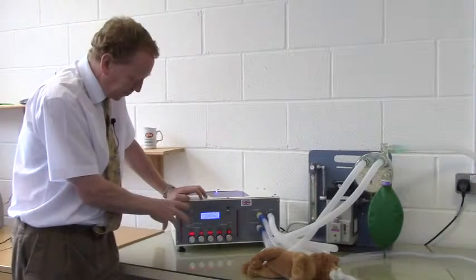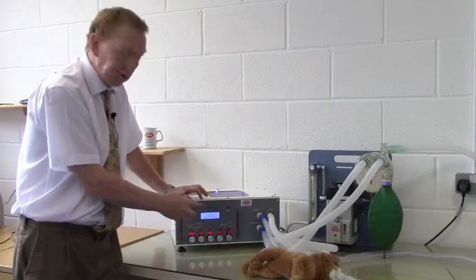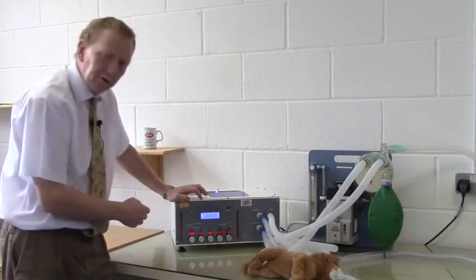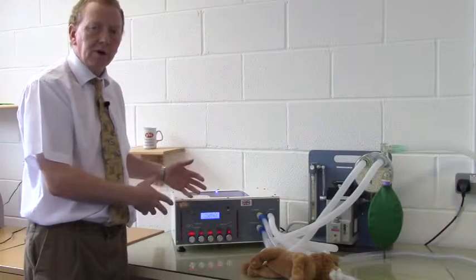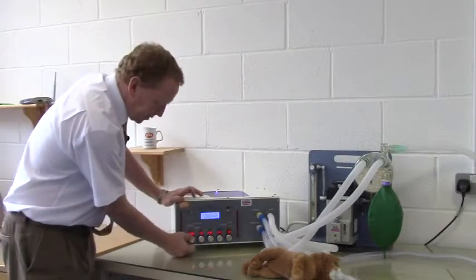So we've set our tidal volume, we've set our inspiratory time, we've set our expiratory time, which dictates our respiratory rate, and now the animal is ventilating at a rate of 15 breaths a minute with a maximum inspiratory pressure of 18 centimeters. Now in practice, if this was 18 centimeters and this was a normal healthy dog, I would consider that to be slightly excessive, and to initially reduce that, I would simply reduce the tidal volume.